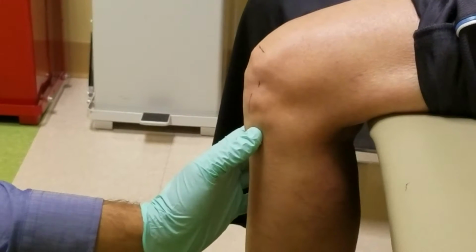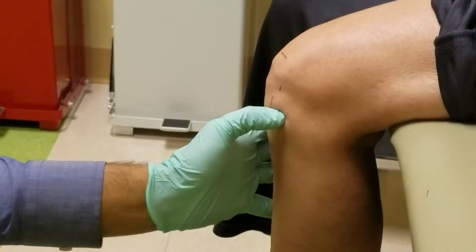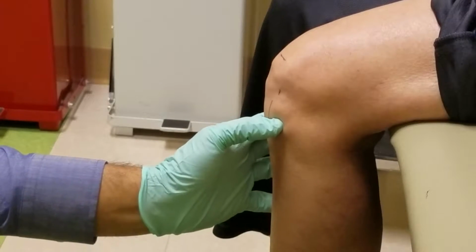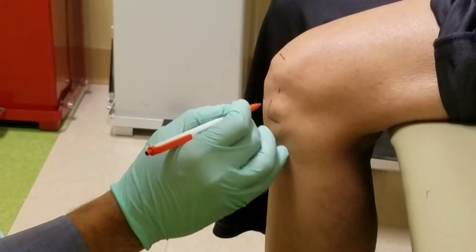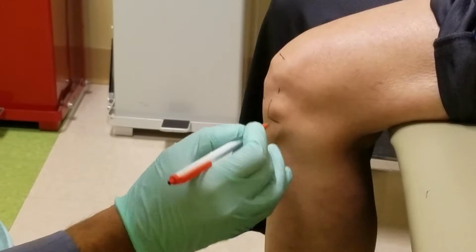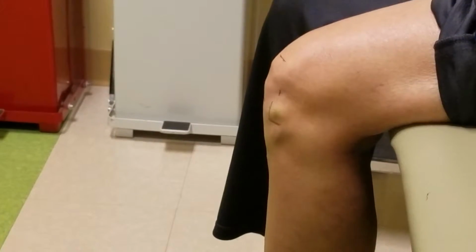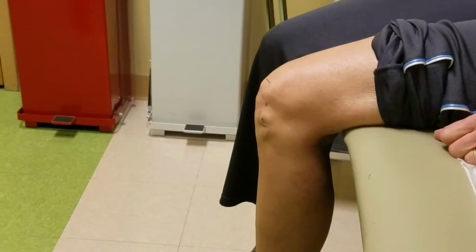And then you can palpate until you fall into a soft spot right over the lateral tibial plateau, and that'll kind of tell you where the joint line is. So you can draw another line there, telling you where that lateral tibial plateau is, and between the inferior pole of the patella, the lateral edge of the patellar tendon, and the tibial plateau is a soft spot where that anterolateral portal is, and that's usually the site for injection. So in this patient, that'll be right there.